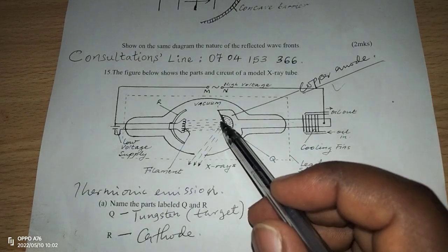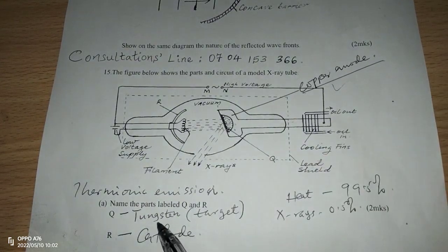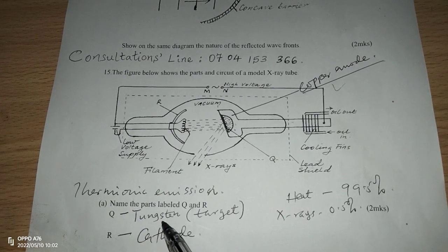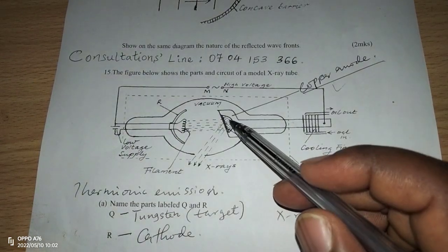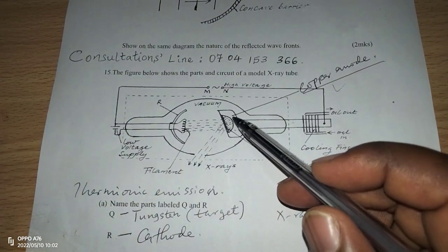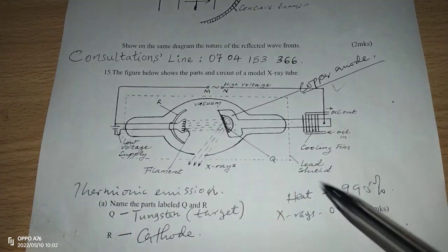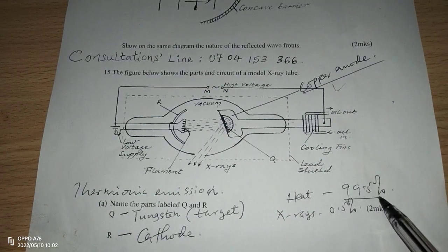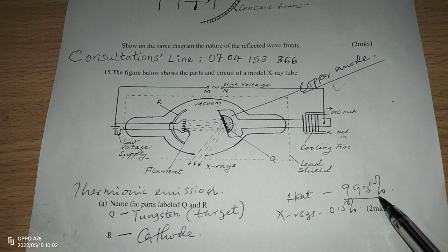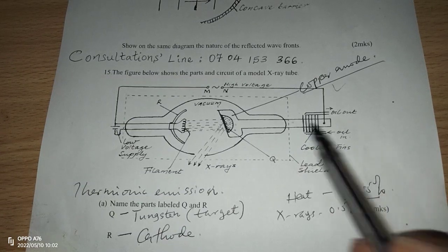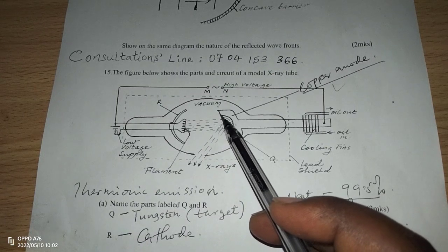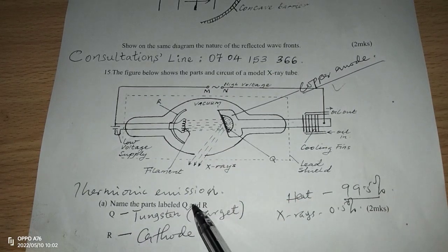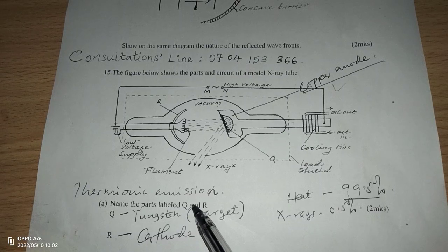That is why the material making the target has to be tungsten, or another metal called molybdenum. The two are preferred due to the high melting point. The high melting point ensures that the two metals are able to withstand the great amount of heat, 99.5% of the energy becoming heat energy. There is a lot of heat being produced at the anode, so the target has to be very hard so that it doesn't melt due to the excess heating.